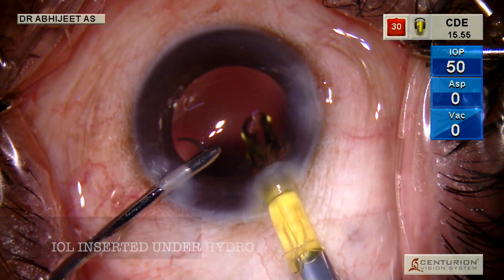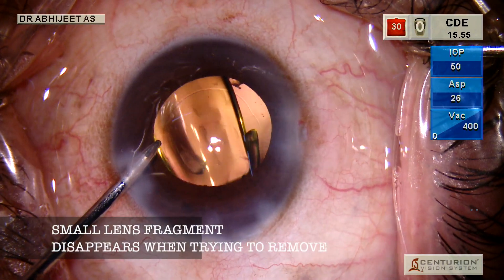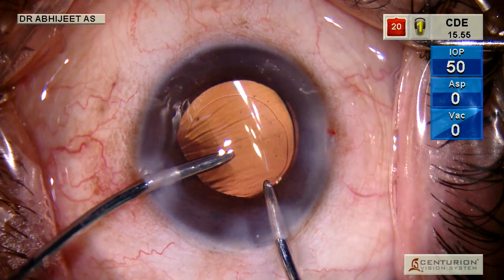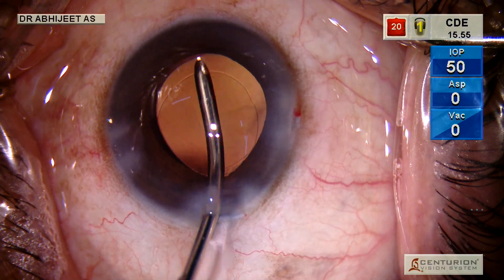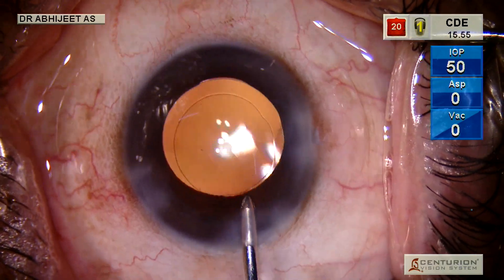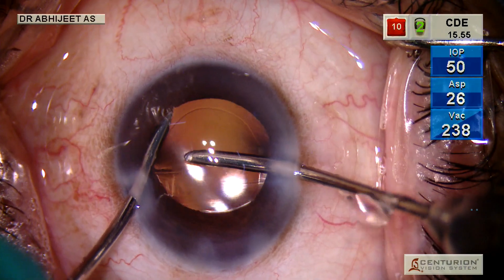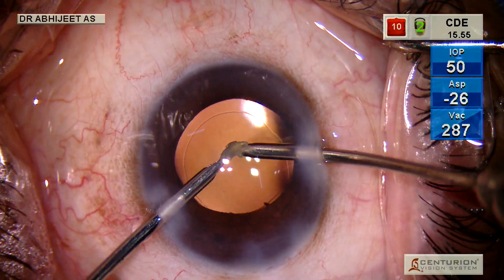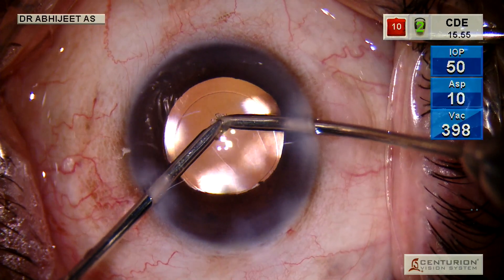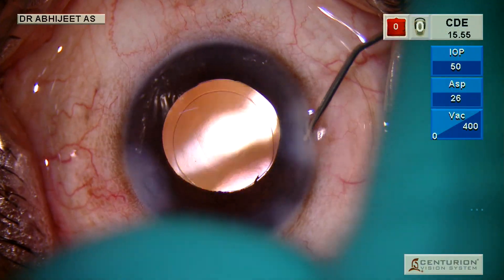We insert the IOL under irrigation, and you can see that small piece which was lost during phacoemulsification has come out, but when I try to hold it again it has disappeared somewhere. I'm trying to search for that small piece — a good idea is to actually go below the iris and give a good irrigation. And there it comes. These are the small pieces which can cause recurrent uveitis postoperatively. We finish the case with a small hydration.